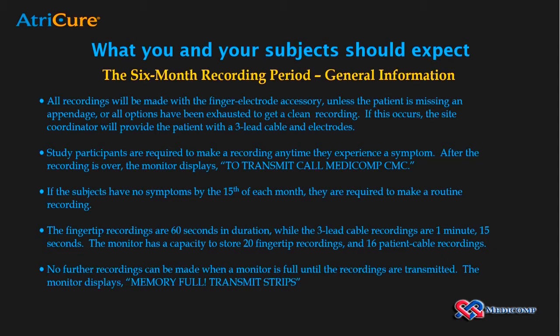Anytime a subject has a symptom, they must make a recording. After the recording has finished, the monitor will show transmit directives on its display. If the subjects have no symptoms by the 15th of each month, they are required to make a routine recording. Fingertip recordings are 60 seconds. Patient cable recordings are 1 minute and 15 seconds.